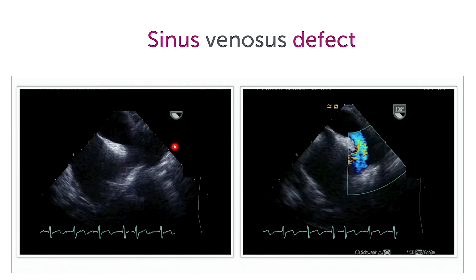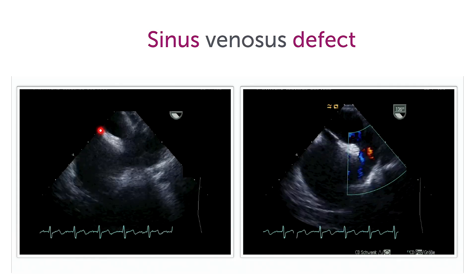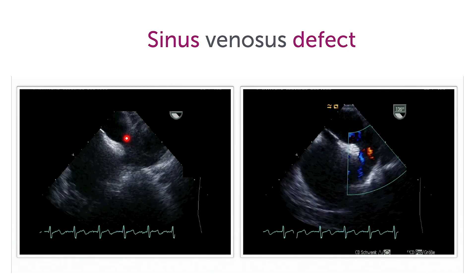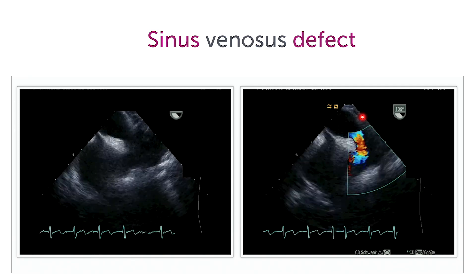Let me walk you through the different parts of the heart that we can see here. This is the SVC. Here is the right atrium. This is the interatrial septum, which is intact, with the so-called primum septum and secundum septum, which is a little bit thicker. And right here, actually almost a communication between the SVC and the left atrium, is the defect. Here you can see that very nicely in color Doppler as well.